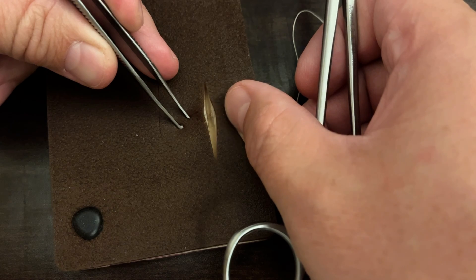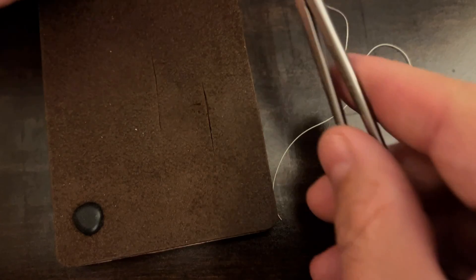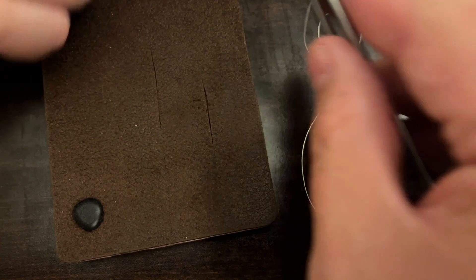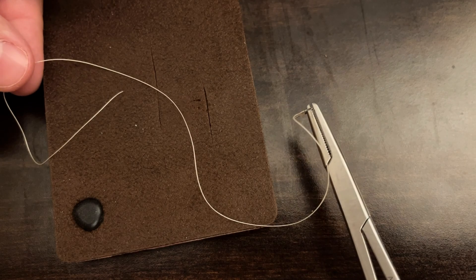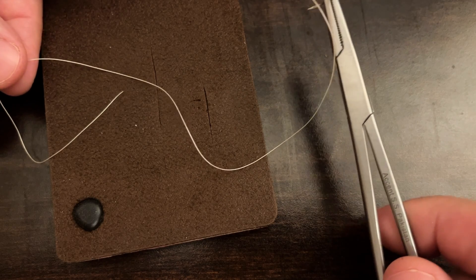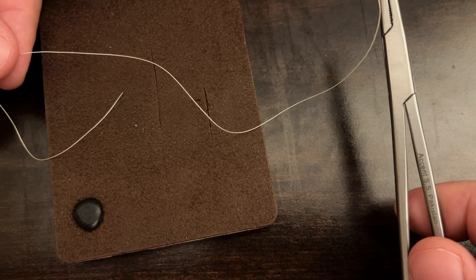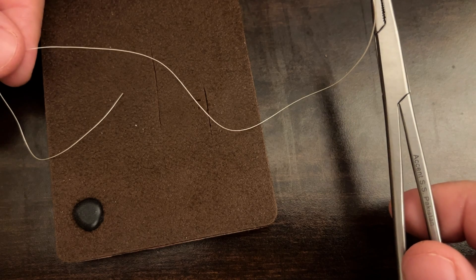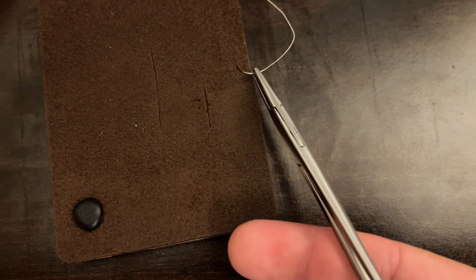For the purposes of this demonstration I'm going to be using Vicryl, which is an absorbable suture. Generally I'll use something like a 5-0 or 4-0 Vicryl — this is a 4-0. Monocryl is another dissolvable suture that is commonly used for subcuticular suturing. My needle's a little big for this today but it's what I have.